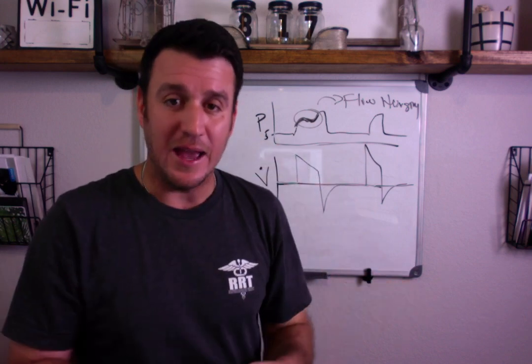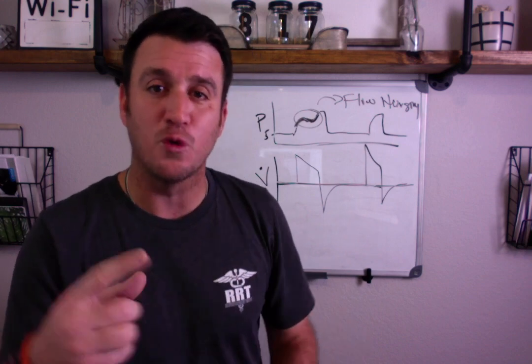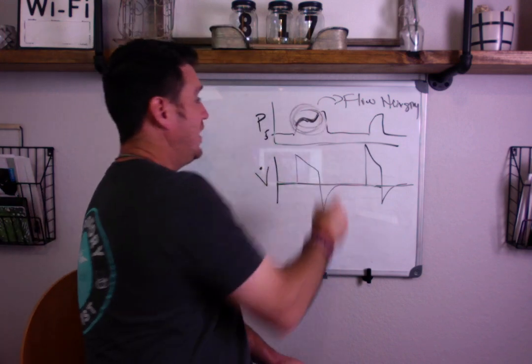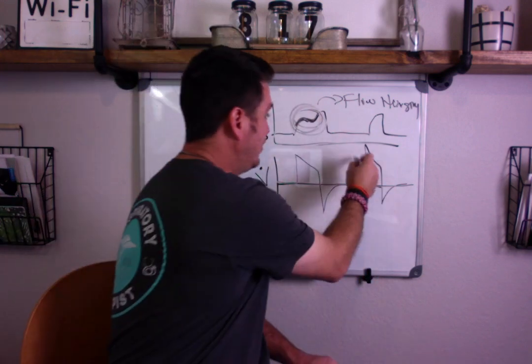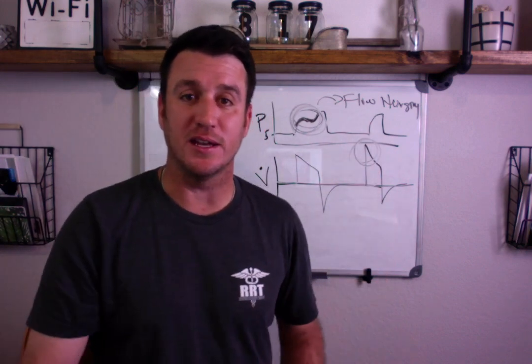We came back the next day and did clinicals the next day. No lie. At the beginning of the shift, we took this exact same patient. We go back in there. Rate is back in the 40s. We see this again. What do? We do this right off the bat, and within an hour, we have them back breathing in the 20s.